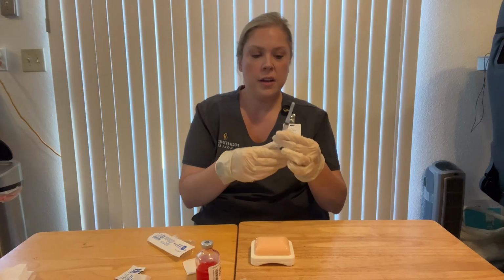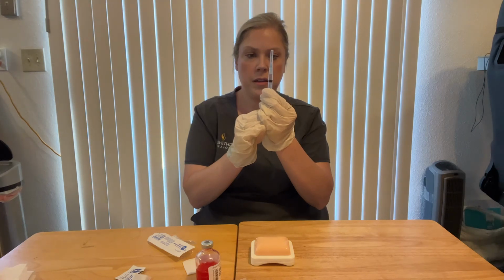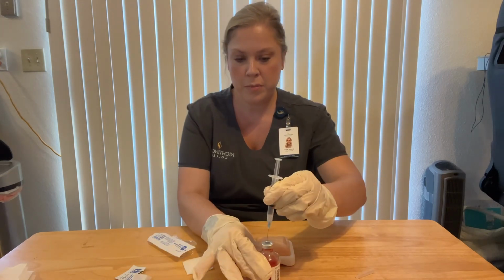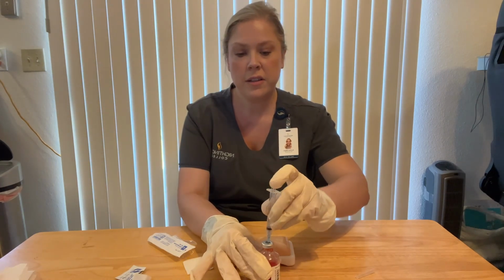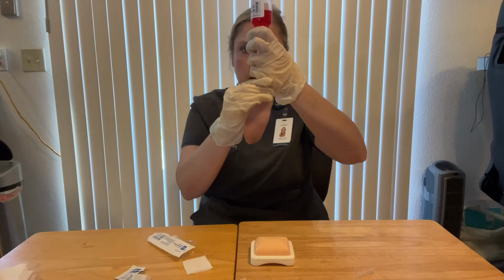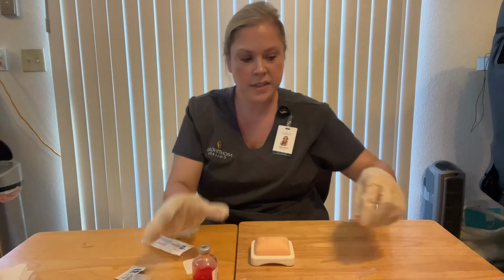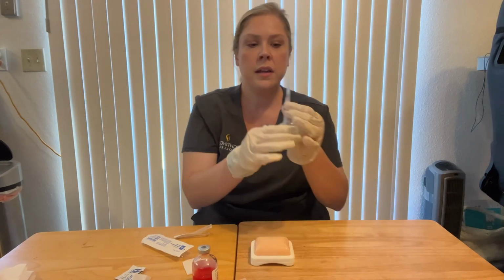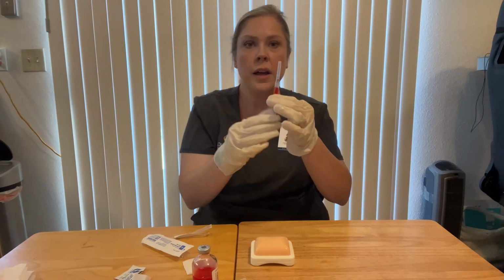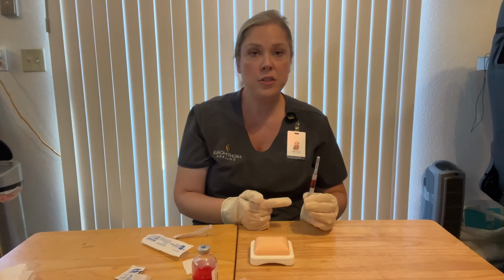I'm then going to want to pull down and withdraw 1 milliliter of air. And then I'm going to want to safely uncap and inject that 1 milliliter of air into the vial. Then I'm going to want to withdraw 1 milliliter of that heparin. Safely recap. I'm going to want to tap for any air bubbles that I may have. Okay. If I was preparing this elsewhere, I'd want to label this with the medication name and dose.